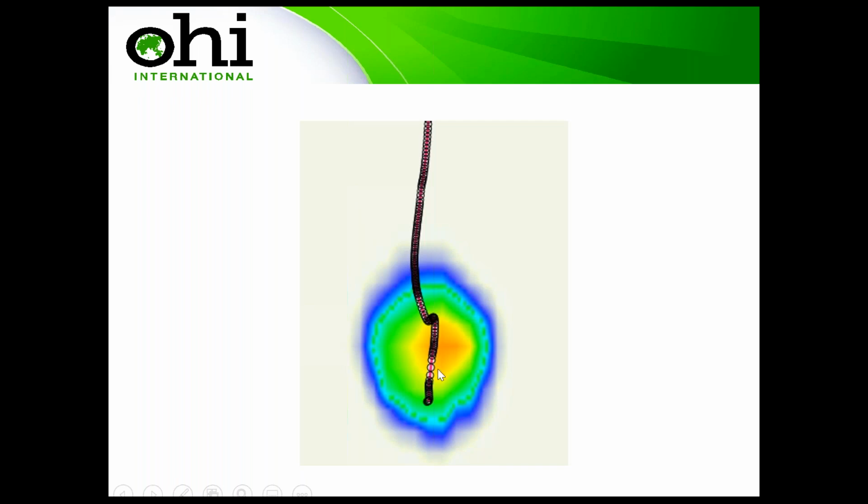Here's another one. Here's a flag, a real squirt through the rear foot, really quick. Look at this big hook. So it goes forward and then there's a real rotation, a real twist happening at the knee. So again, it's not telling us that this person's got a damaged knee. It's telling us that we need to look a little bit more and examine the knee to see is there anything that we need to look at now.